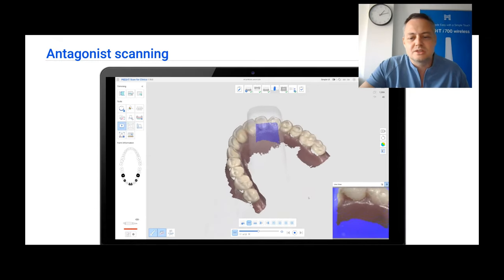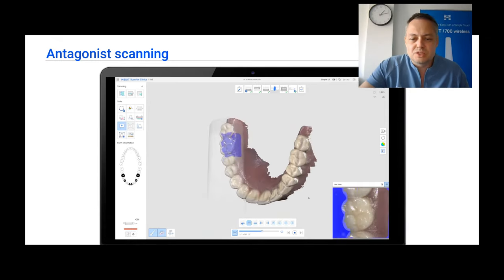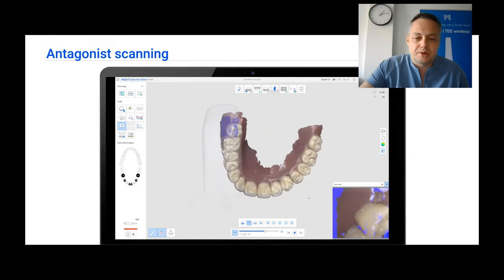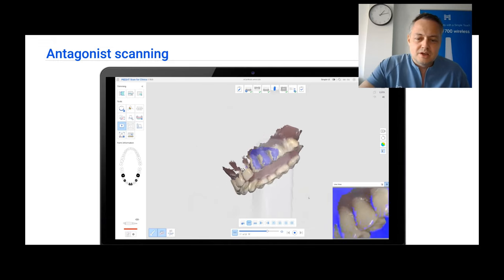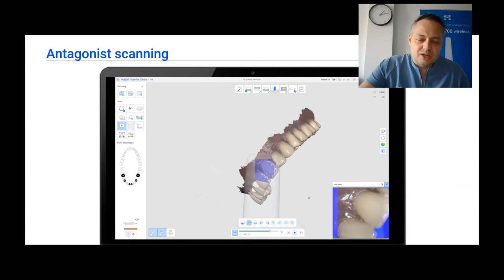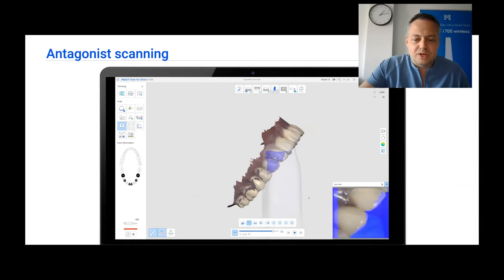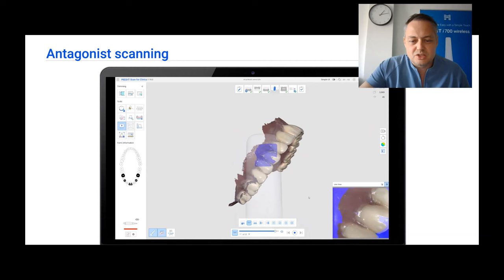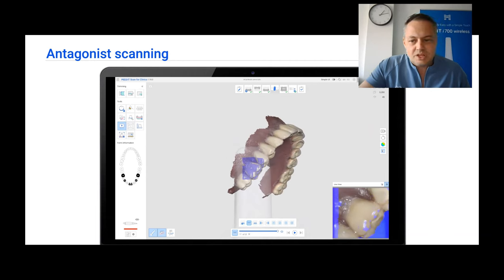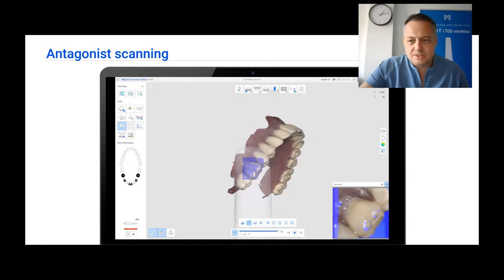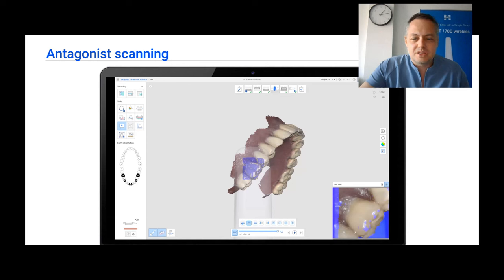For the additional scan, what we see here is the scanning of dentures. We start from the occlusal surface, then we go to the palatal surface and then to the labial surface of the denture and we scan everything together. We make sure that the scan is precise and then we are done here in this step. If we would like to also get the interior of this full denture, we should first reline it with material and then start the scan from the inner side of the denture and go to the teeth.